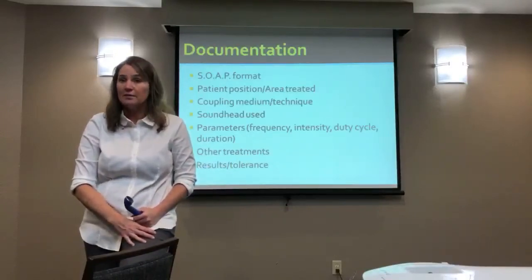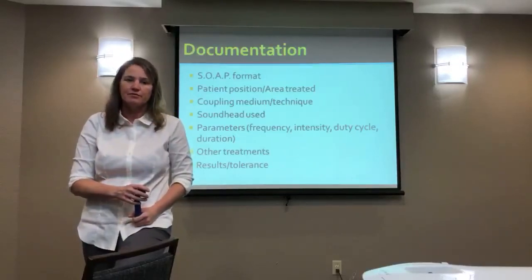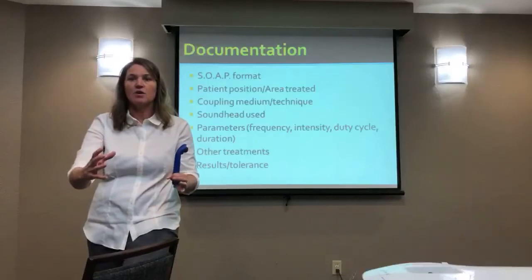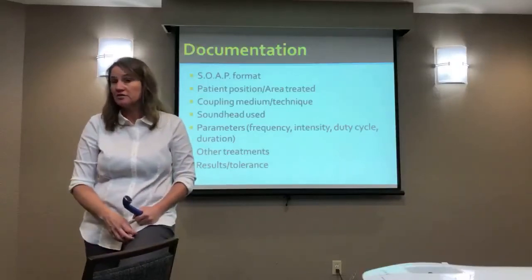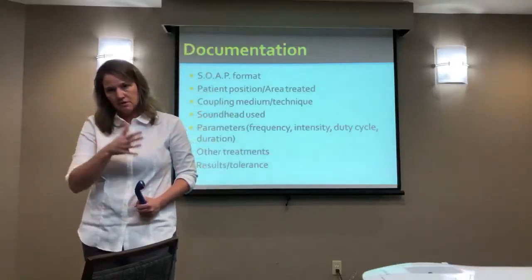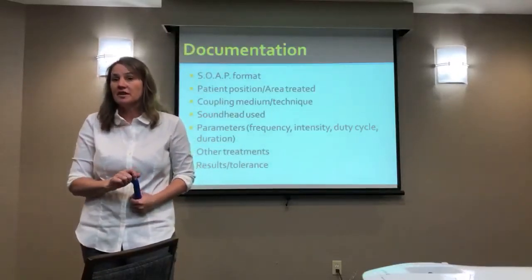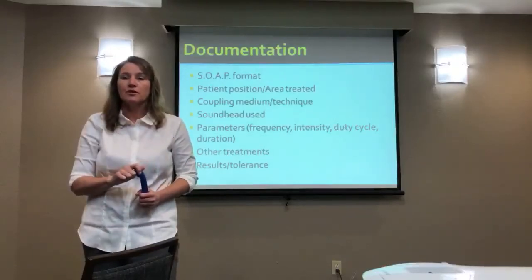It's a good point, and I'm not going to be able to answer it so much as it's a case-by-case basis versus a known negative outcome. Drugs, for sure. You're only supposed to put this much drug in a person this much of the time, but from an ultrasound perspective, I'm not aware of any point where you've gone too far and you could cause harm.